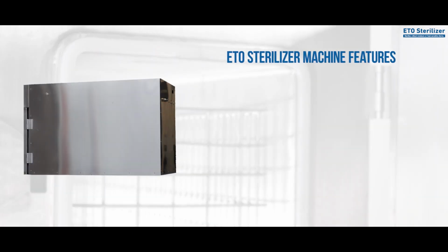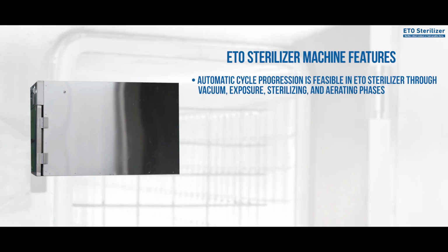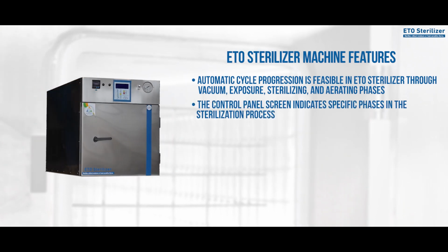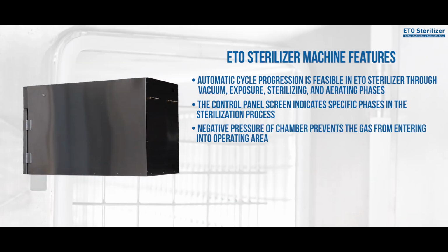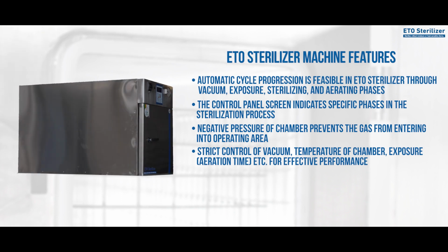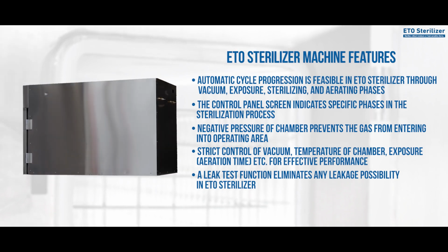ETO sterilizer machine features. Automatic cycle progression is feasible in the ETO sterilizer through vacuum, exposure, sterilizing, and aerating phases. The control panel screen indicates specific phases in the sterilization process. Negative pressure of the chamber prevents the gas from entering the operating area. Strict control of vacuum, temperature of chamber, exposure, aeration time, etc. for effective performance. A leak test function eliminates any leakage possibility in the ETO sterilizer.